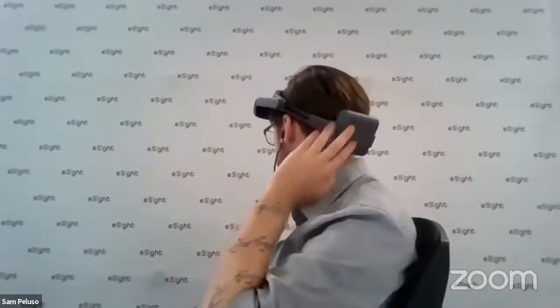Yeah, so the way it's supposed to be worn, because the battery is probably the heaviest part, that part is supposed to go where the neck joins. Yeah, there. You can see, right, on the back, and then the top of the halo goes higher up, above the forehead. As long as you've got it in the correct position, which it naturally falls into anyway, then I agree, the weight distribution is really quite good.